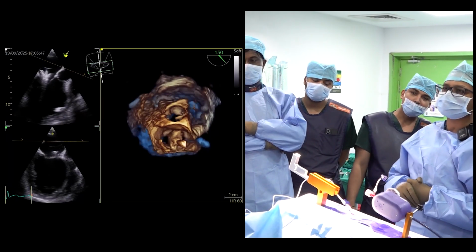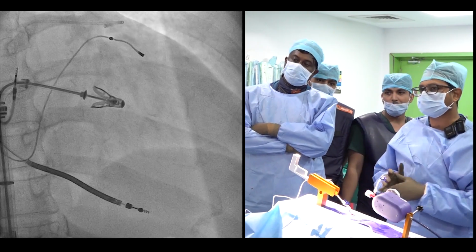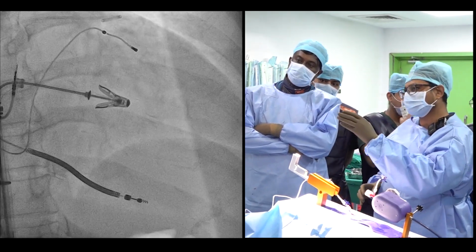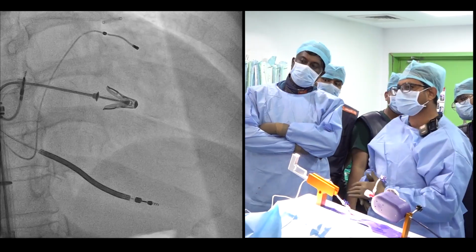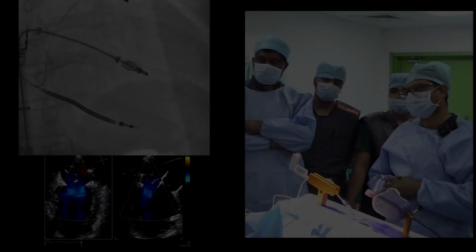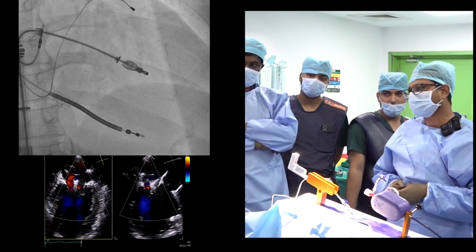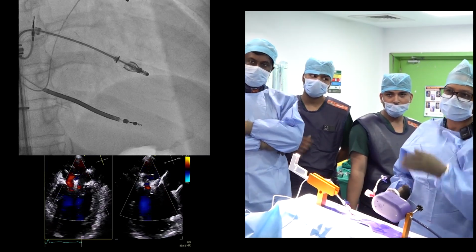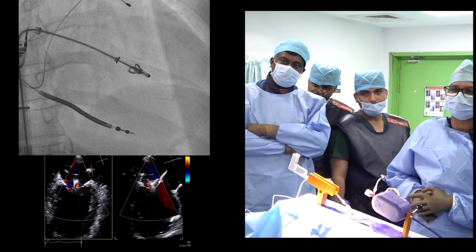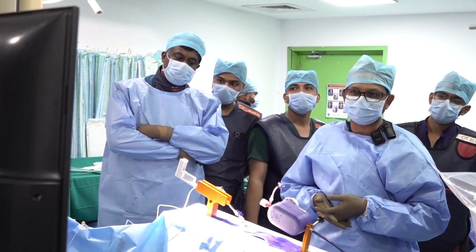This is a good position to dive into the LV. Then we close the arms of the MyClip. You can appreciate that we have closed the arms to 60 degrees, and this is the time to dive into the LV. Now with the 60 degree angle we are diving into the LV, and we simultaneously watch the echocardiogram so that both arms lie onto the anterior and the posterior mitral leaflet.